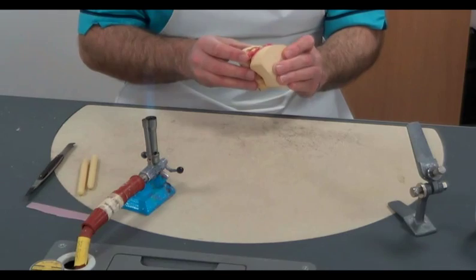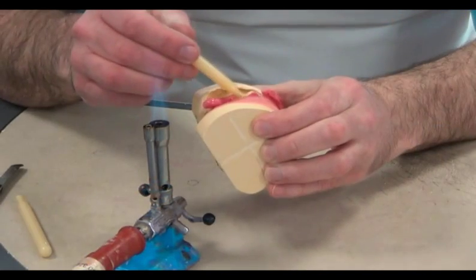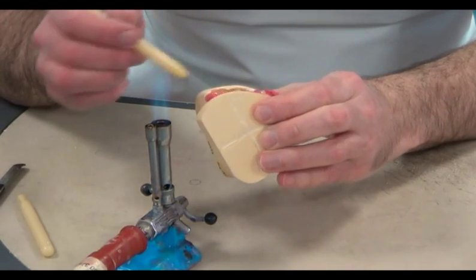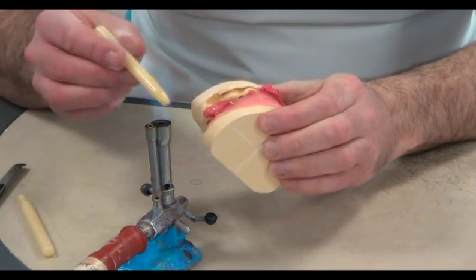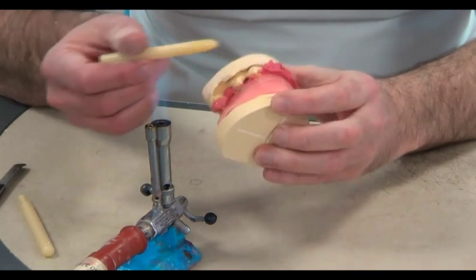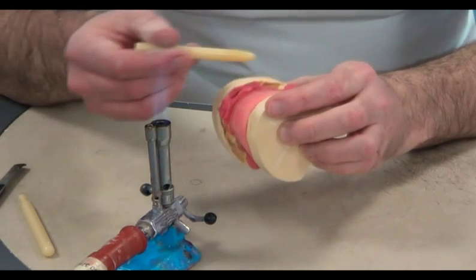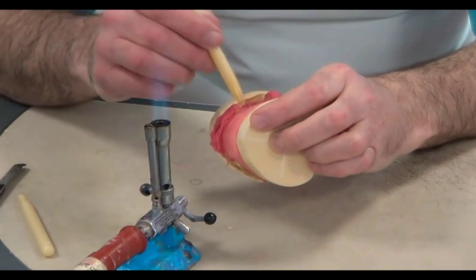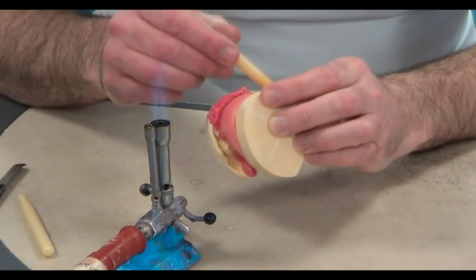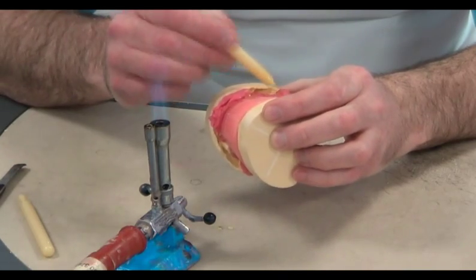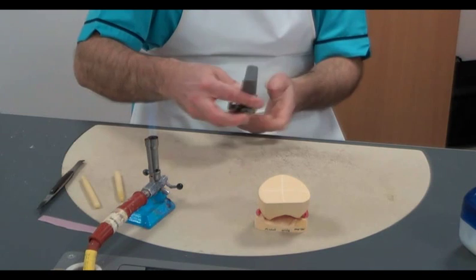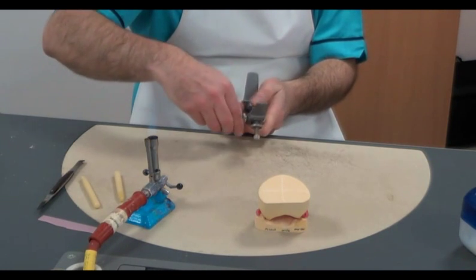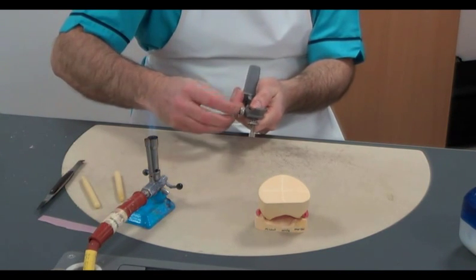We now locate the two models together in the correct occlusal position using a small application of sticky wax. Now the upper and lower models are firmly held in place, we're ready to proceed with the articulation process.